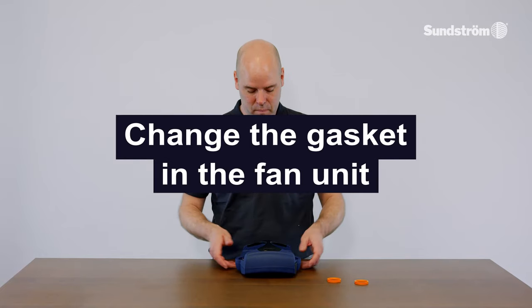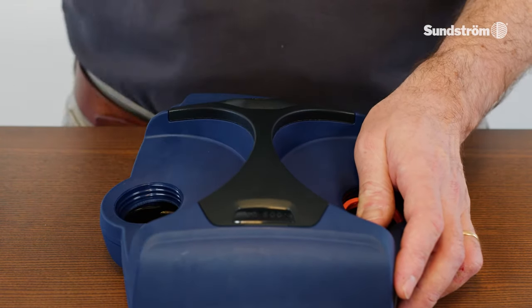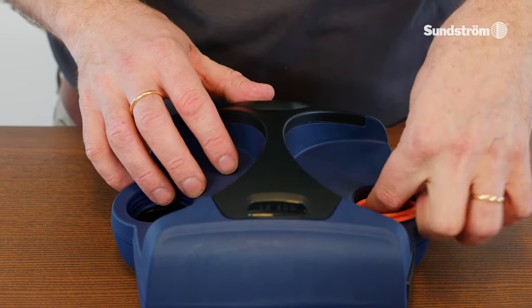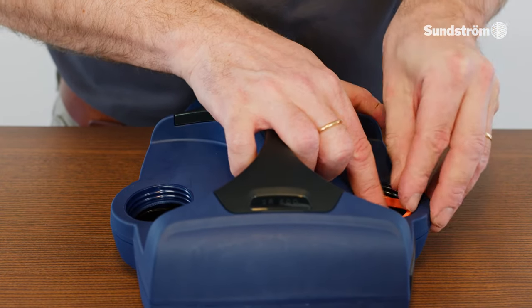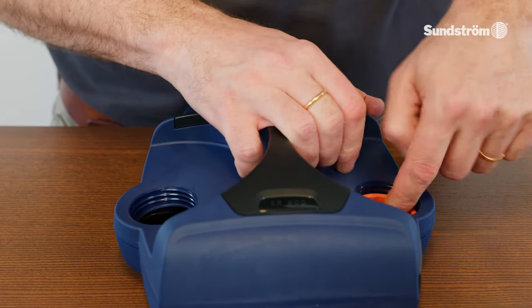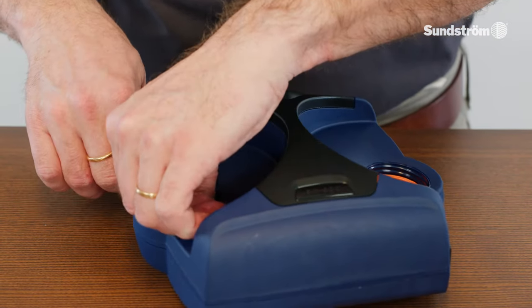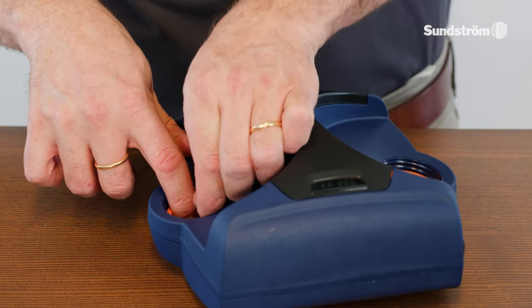Changing the gasket in the fan unit. Remove the old gasket. Fit the new gasket onto the flange, and check that the gasket is in place all round.